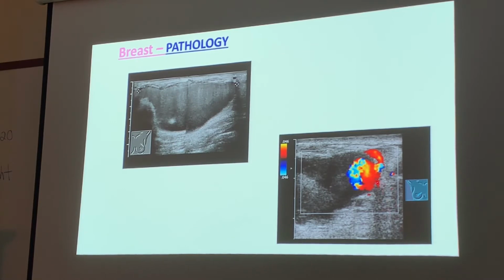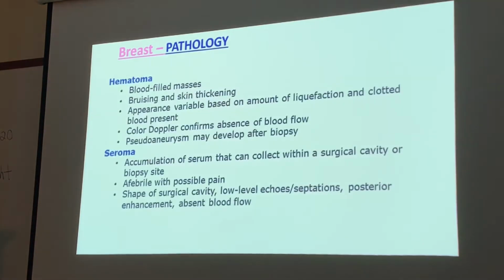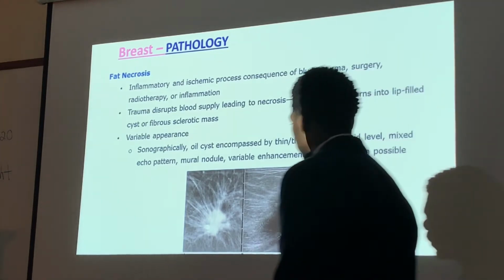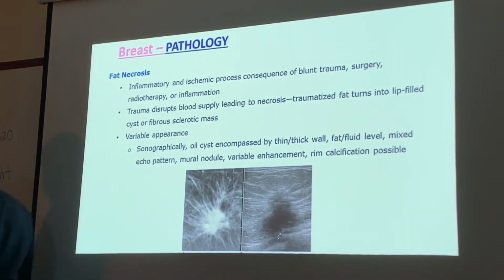But yeah, that's what a pseudoaneurysm would look like after biopsy. Okay. And finally, fat necrosis.